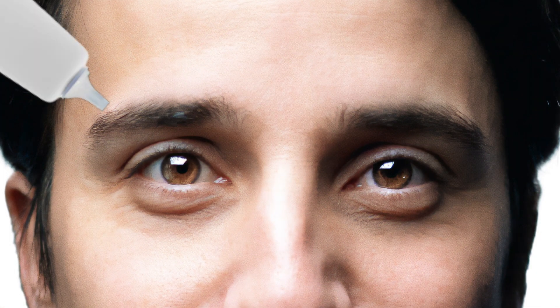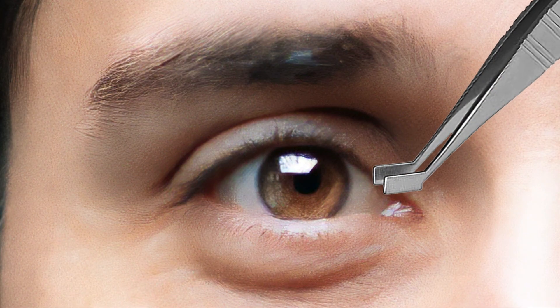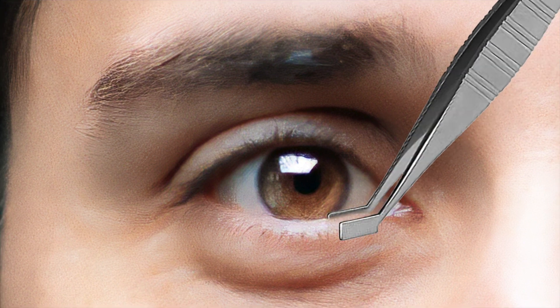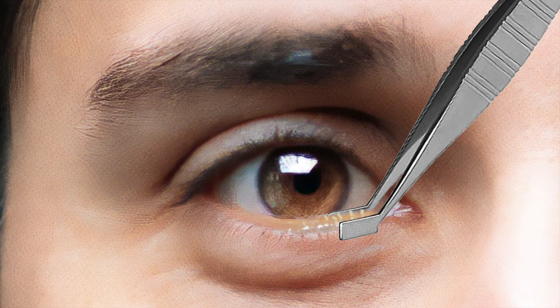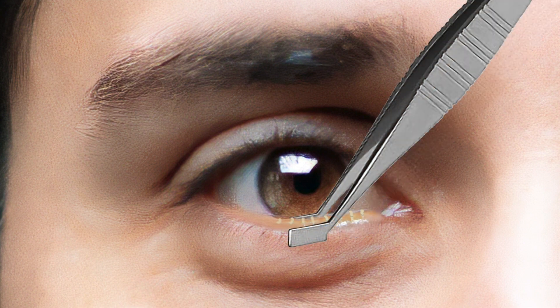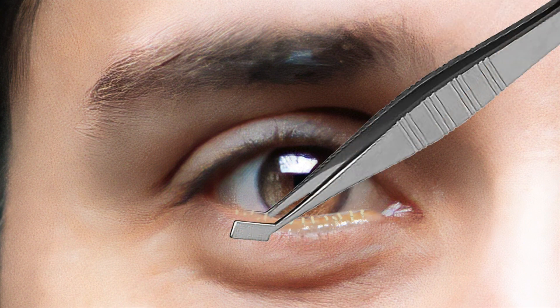Meibomian gland expression is performed by first placing some numbing eye drops. A gland expressor forcep is then used to gently compress the eyelids, causing any thickened oil and debris that is clogging the meibomian gland to come out. This manual expression is performed all along the eyelid margin. Complete expression of the glands can increase overall quality of oil production and decrease dry eye symptoms.